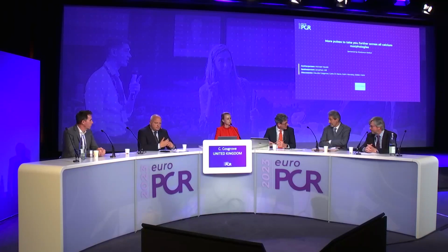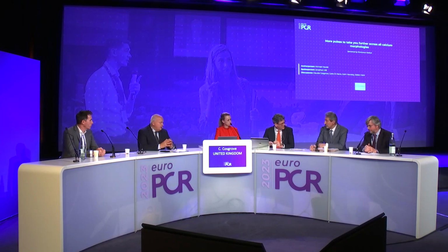Maybe I could ask the same question to Colm, Stefan and Carlo. Have you been using this for eccentric nodular calcium right from the outset? I think that we moved to use it more often on nodular calcium and eccentric calcium based on the data that we had from Disrupt showing similar expansion.